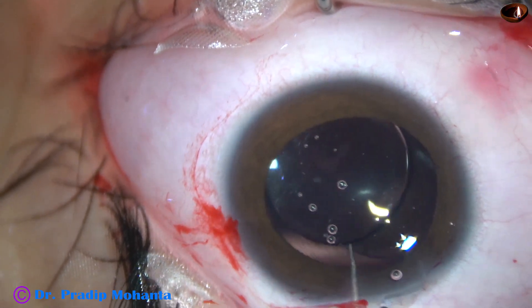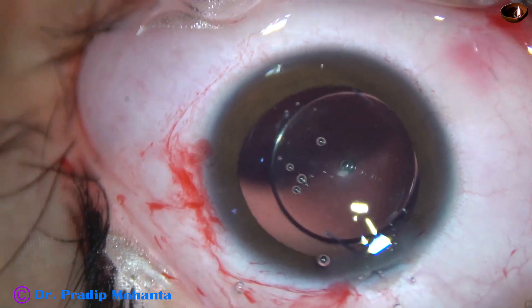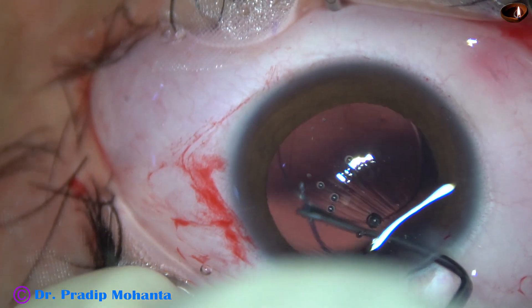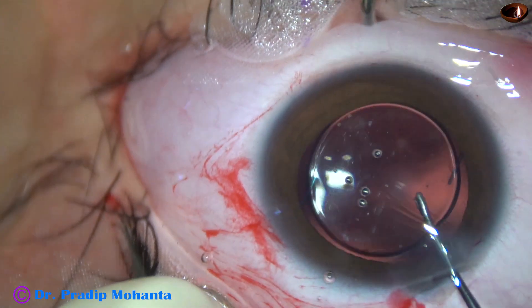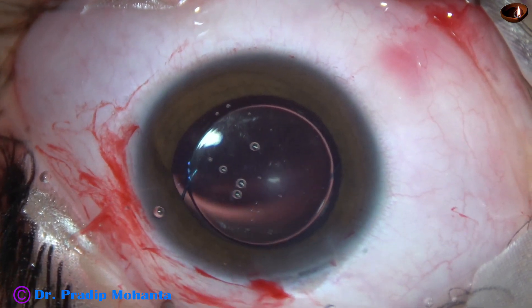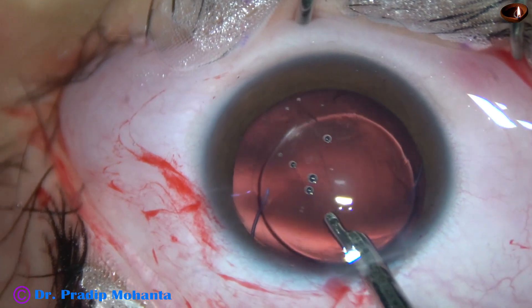I tried to place the haptic in the bag but it has gone into the sulcus. Now it is going to be difficult with the Sinskey hook. If I had a side port on the right side it would have been easier, but when I use the main wound with this Y-pusher instrument, I can press the haptic-optic junction posteriorly in a much better way than the Sinskey hook. The trailing haptic has now gone into the capsular bag.